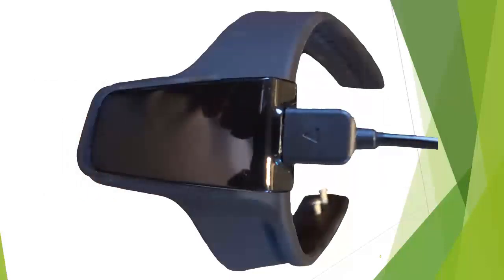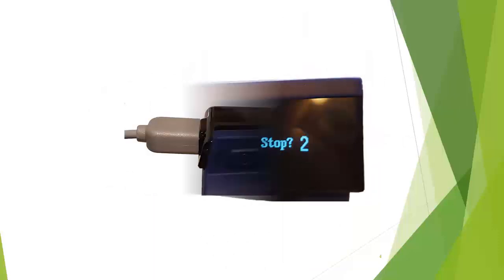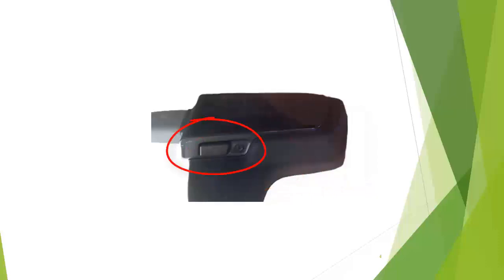In the morning, when you are ready to end the test, remove the wristwatch and thumb sensor. The wristwatch may start to count down. Wait for the countdown to complete, then power off the wristwatch by pressing and holding the power button for 3 seconds. Return the wristwatch to your prescriber where they will review the results with you.